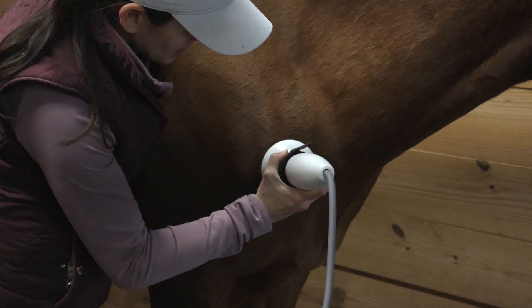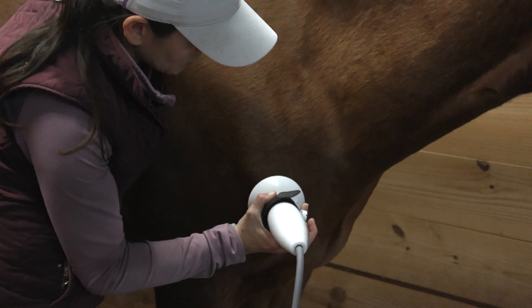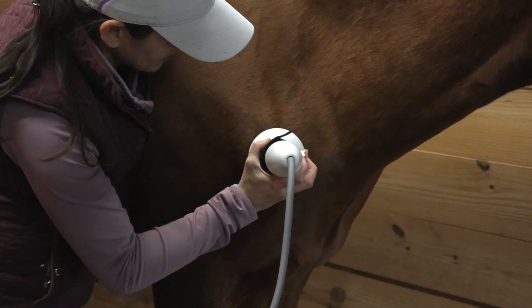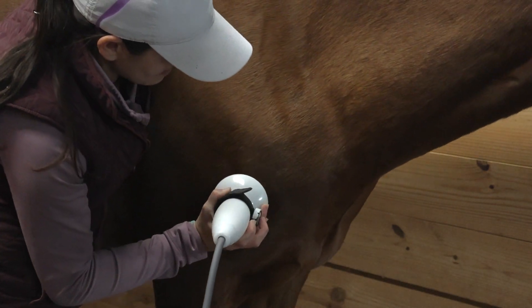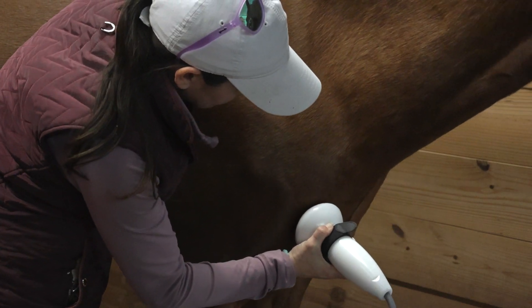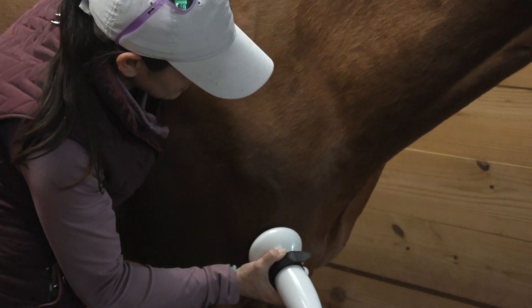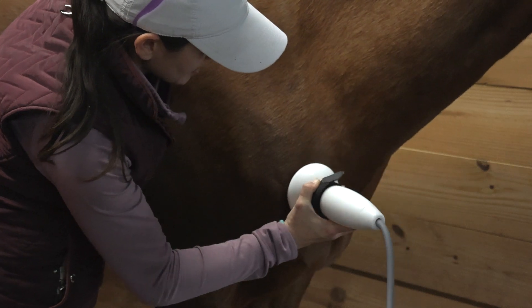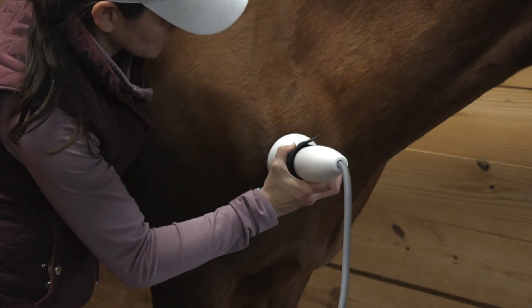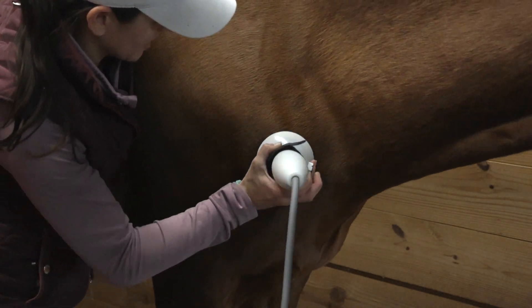With the shoulder, you're going to be able to have a little bit more circumferential coverage. Coming right around that joint, I find that creating a consistent pattern ensures that I am getting the entire joint region, versus focusing on just one side of the joint.